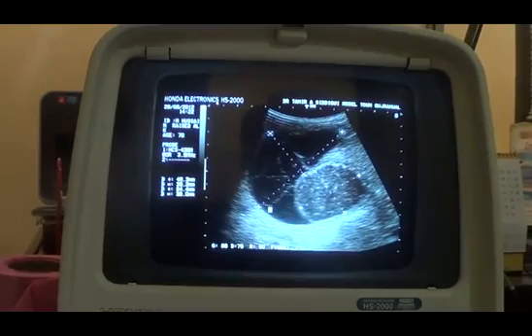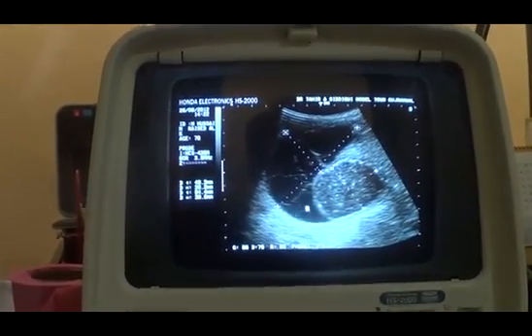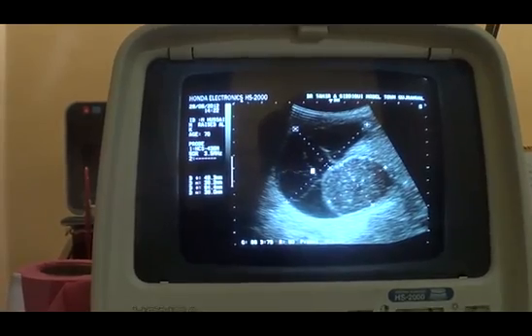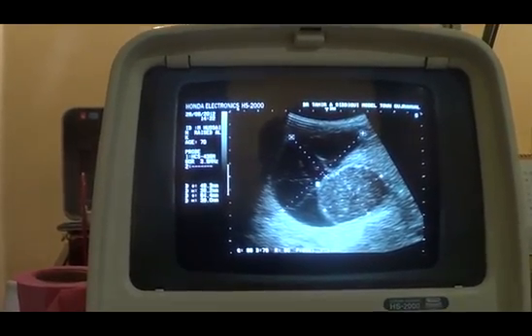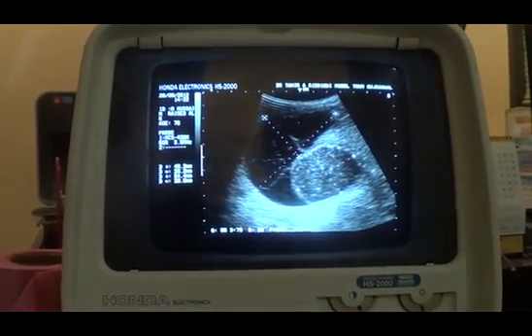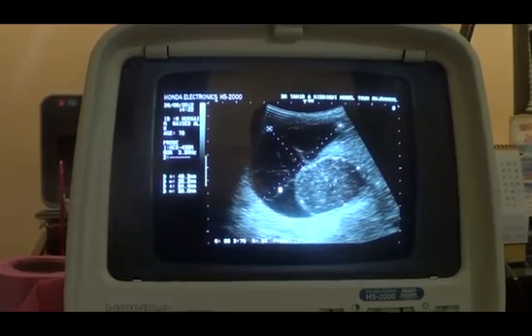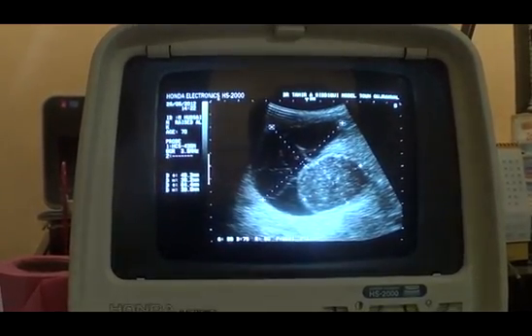This is debris within the fluid. This is clear fluid, all black. This is fluid with debris. You can see slight echogenicities and sand-like particles. These are thin septa. This is a septa. So the multiple septa are radiating from the wall of the gallbladder, and they extend up to the margin of this loculated fluid pocket that is also infective in nature by sonographic parameters.